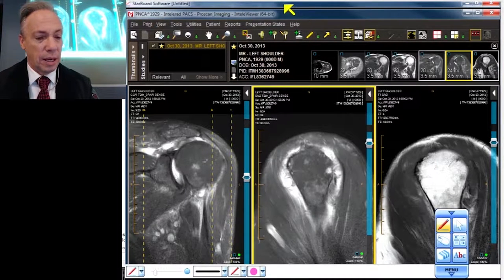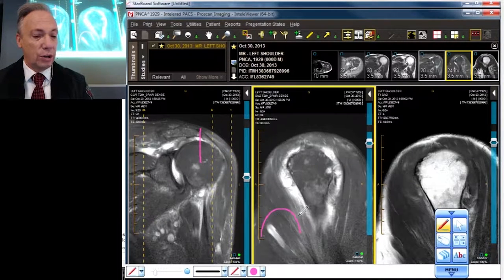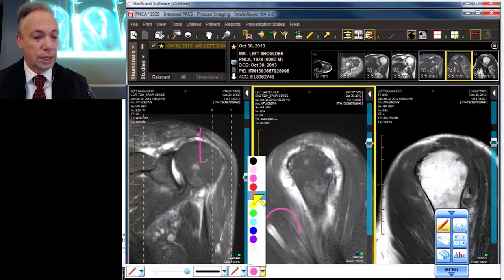I'll make a humeral head in pink and let's pretend we're about over here, at this location. At that location you're going to see a fair amount of muscular tissue.